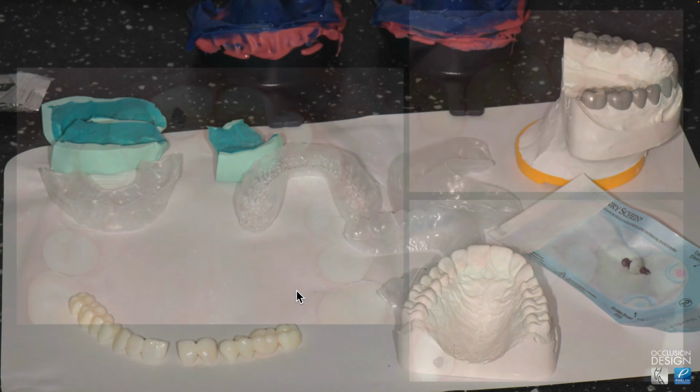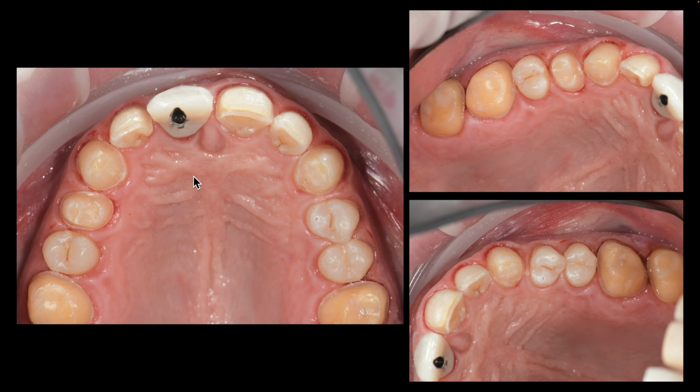Here are shade photos. Here's everything here. And here are the preps. So this is interesting. You can see, again, conservative veneer preps. Oh, yeah, the cuspids, because we needed more contour on the palatal of the cuspids for occlusion, I did basically what we call more of a glove crown around this. This will be a feldspathic veneer that wraps all the way around the prep. And we've got still enamel on the palatal too. So it's a 360-degree crown. Veneer that's like a crown, but light chamfer all around.